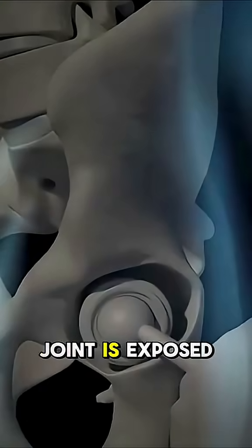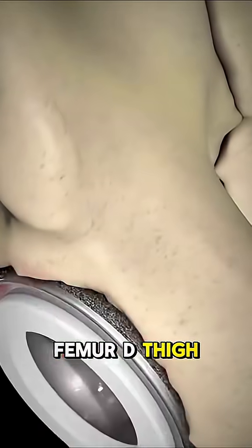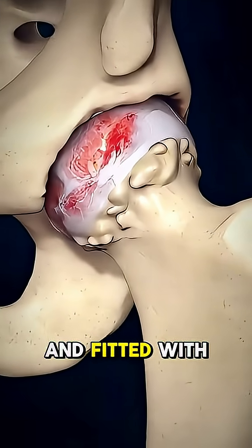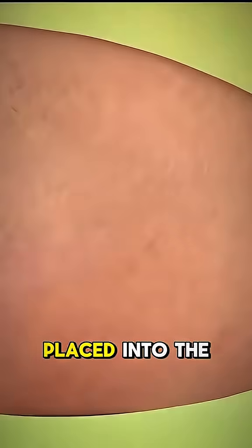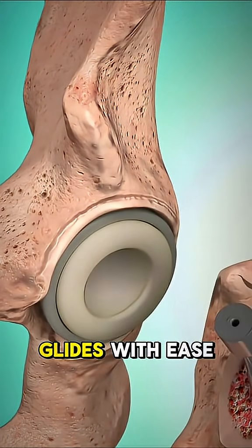Once the hip joint is exposed, the worn-out head of the femur — the thigh bone — is removed. The socket in the pelvis is then cleaned and fitted with a new, durable cup. A titanium post with a smooth, rounded ball is placed into the femur, creating a new artificial joint that glides with ease.